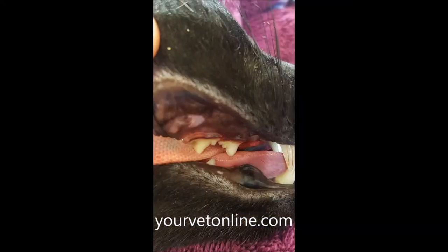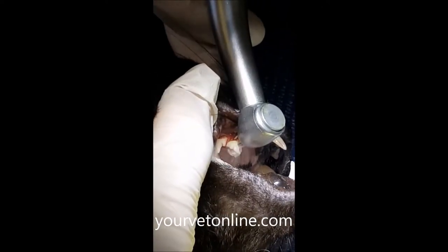In this video, we're going to be talking about tooth removal in a cat, specifically the first premolar that has two roots.